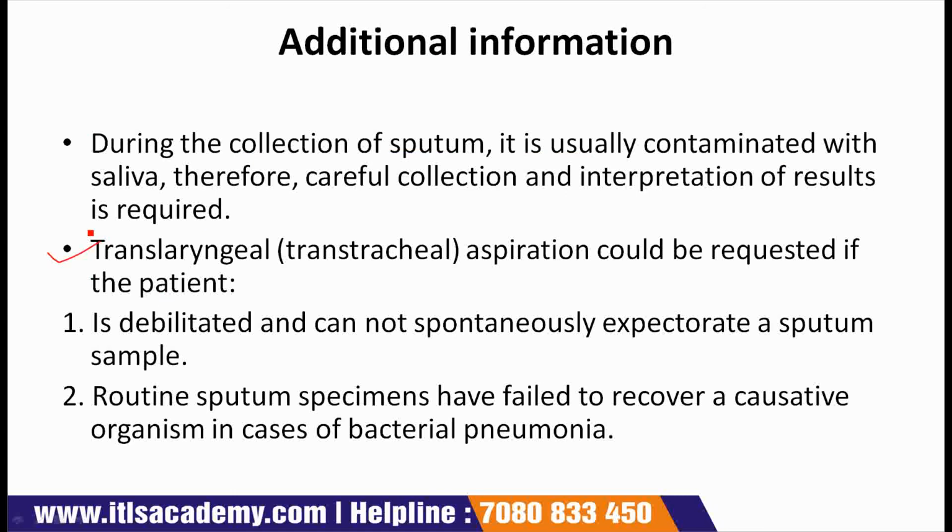Next point is translaryngeal, that is transtracheal aspiration, could be requested if the patient is debilitated and cannot spontaneously expectorate a sputum sample.